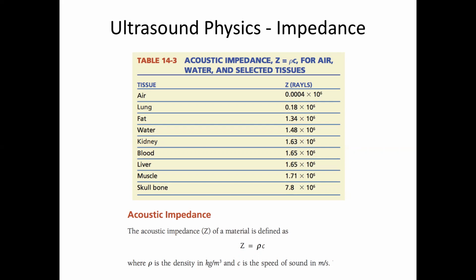It goes ping, goes out, and it's like 1 megahertz of sound, but it's only a couple of microseconds long. That travels through the medium, and then it hits a reflecting surface. What comes back is a reflection of that, and you measure that signal on your detector.